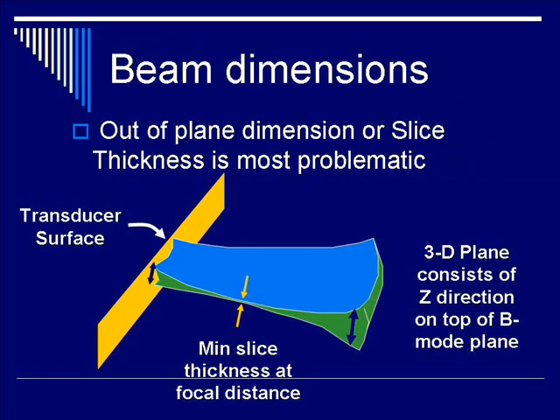The further you are from the transducer surface, and especially beyond the focal zone, you can see that the thickness of this z-plane or slice thickness direction is significant. This partial volume effect, which you see also in CT scanning, can creep up to the two-dimensional image that we discussed in the previous slide and thus affect the resolution by introducing artifacts that are not real.